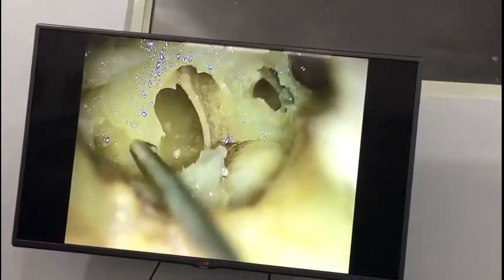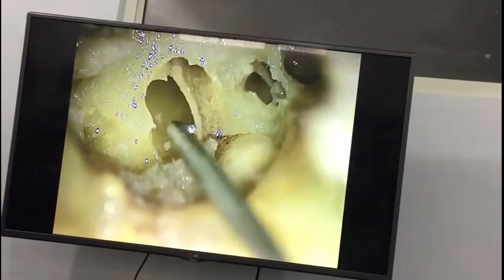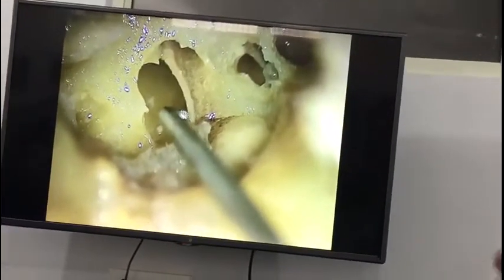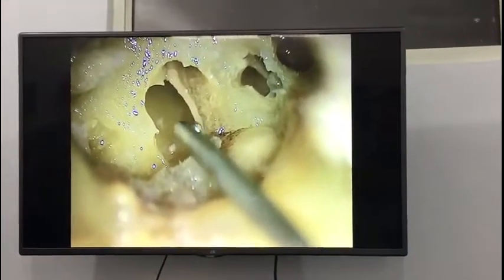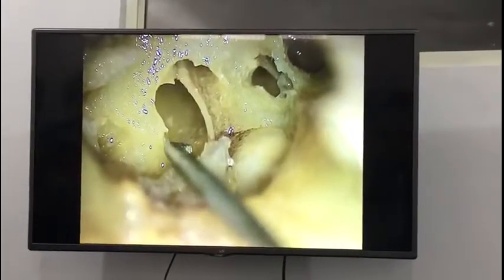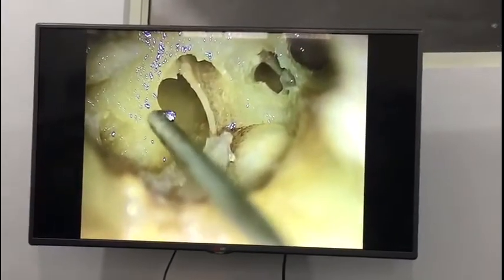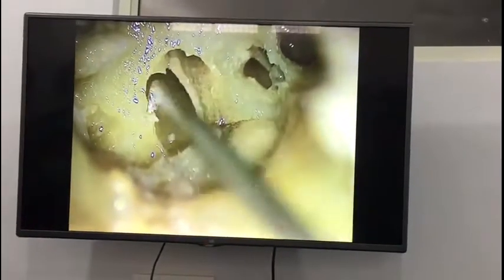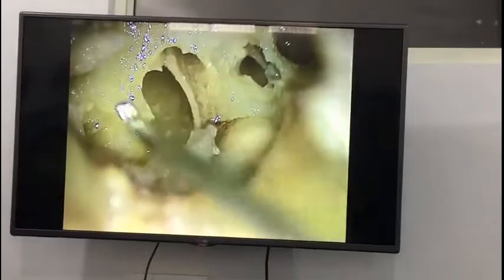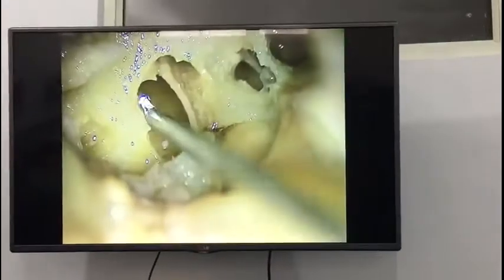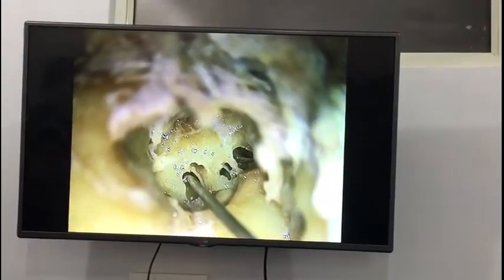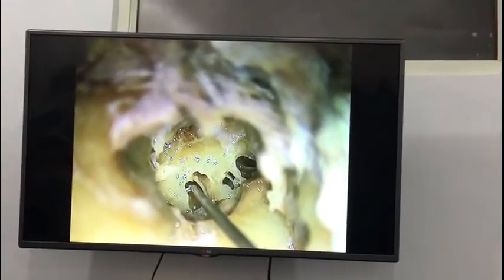When you draw an imaginary line, you should not make the cochleostomy anterosuperiorly here, because you will injure the osseous spiral lamina and it becomes a grade 4 cochlear trauma. You have to place the cochleostomy anteroinferiorly — here or here. This is the inner side of the outer wall of the cochlea, which is the OWC.